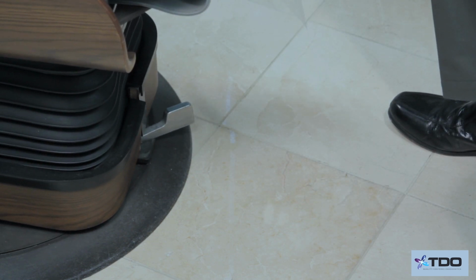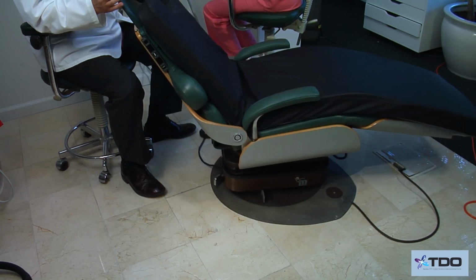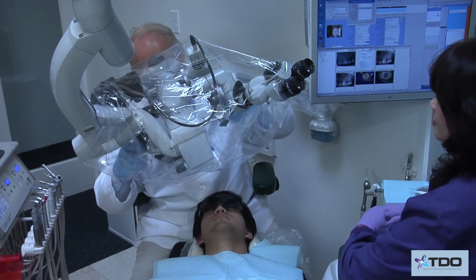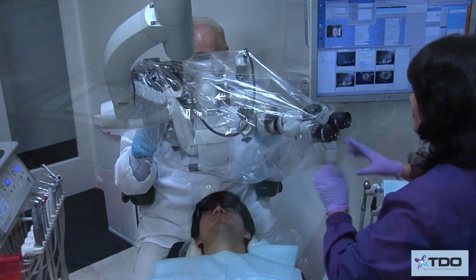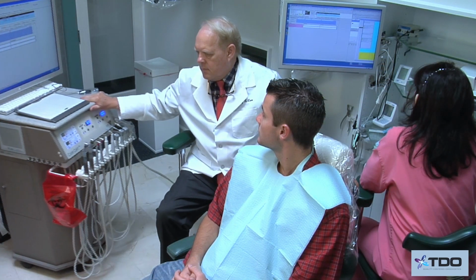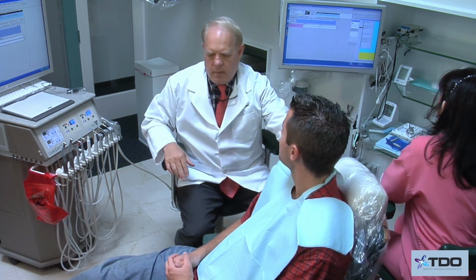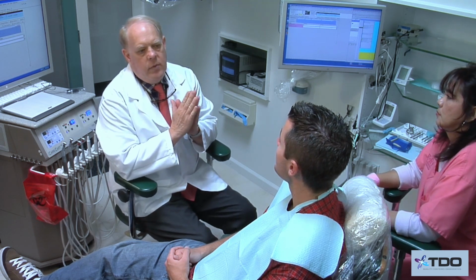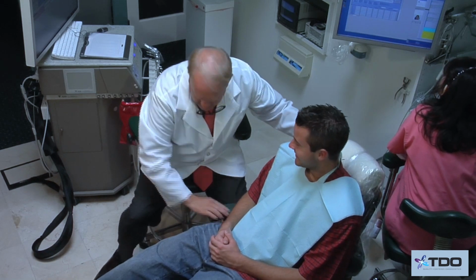A chair that is difficult to move will impact microscope use significantly, and the doctor will be forced to move the scope instead, and this will introduce a great deal of inefficiency. Even as simple a thing as rotating the patient so you can face them directly is made easier by a chair that feels like it is floating, as shown here. Whereas a chair that is locked makes even a simple thing like rotating the chair more difficult, as shown here.